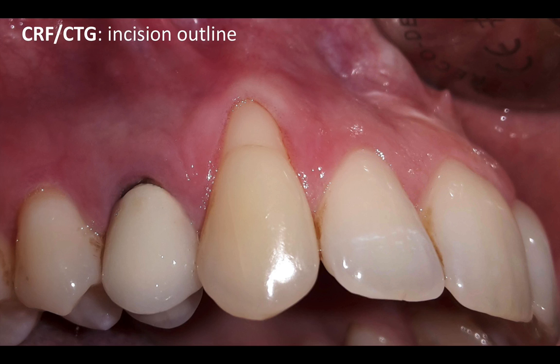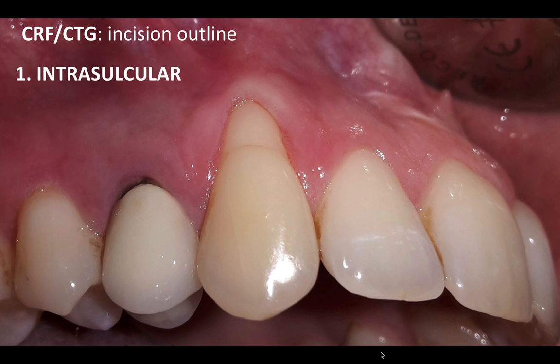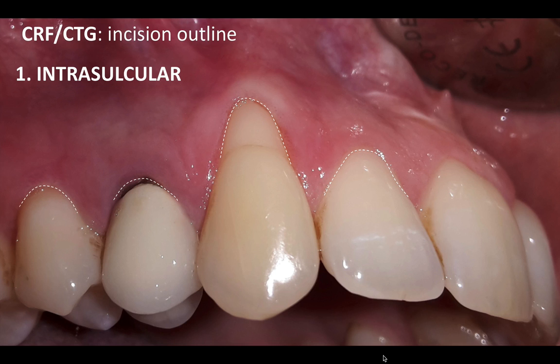This is going to help you when you have a similar case in your office, and I hope this helps Dr. Domic as well. The first incision is an intrasulcular incision with a blade or a microblade right into the sulcus of the teeth with recession. For a conventional connective tissue graft, you need to extend this split-thickness flap also into one tooth adjacent. In this case, I'm going to create an intrasulcular incision into the adjacent premolar and the lateral incisor — this is typically the mesiodistal extent of my flap to treat these two teeth.